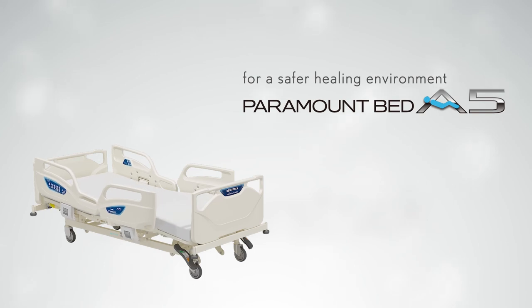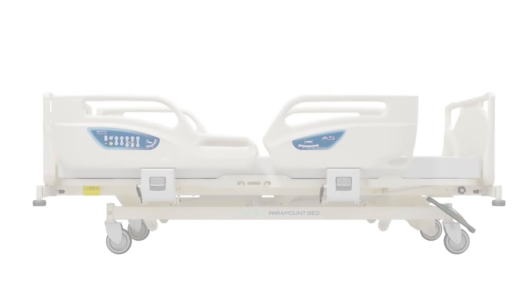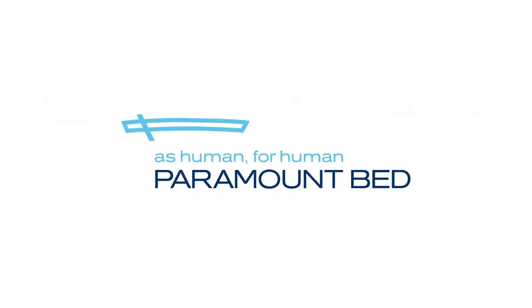For a safer healing environment, the Paramount Bed A5 series. Produced by Paramount Bed.